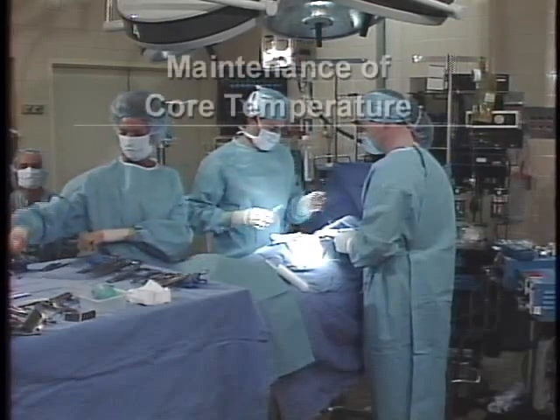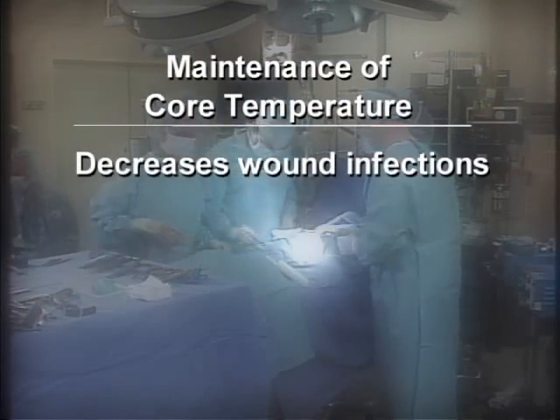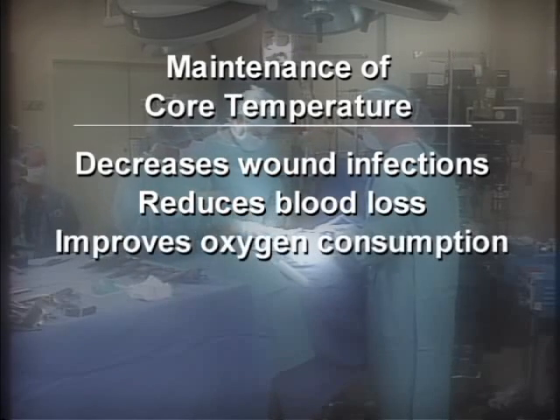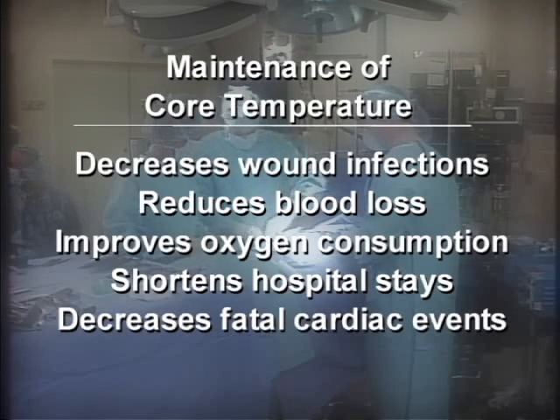Studies have shown that the maintenance of a normal core temperature decreases the incidence of wound infection, may reduce blood loss, improves oxygen consumption, shortens the hospital stay, and helps decrease the incidence of fatal cardiac events.